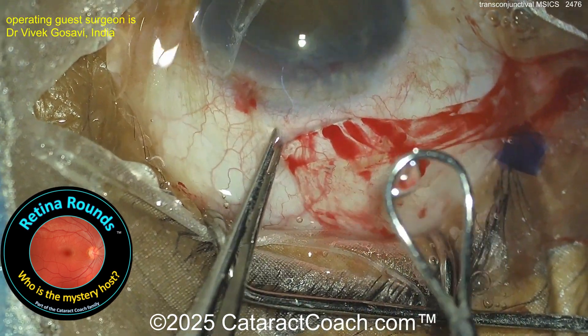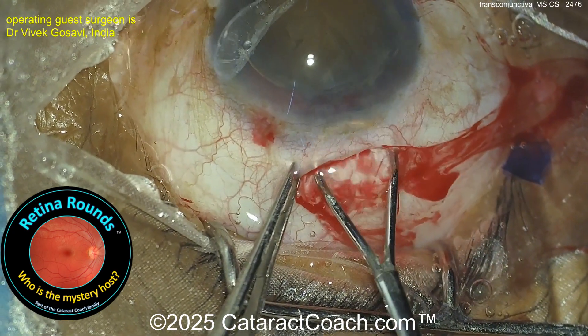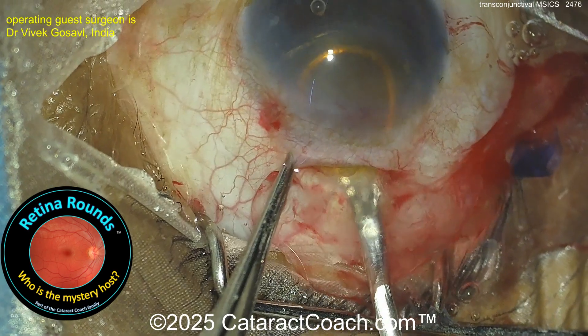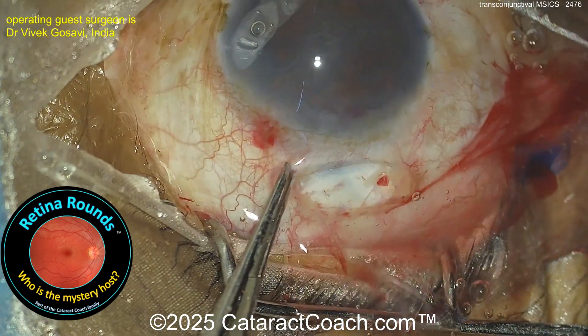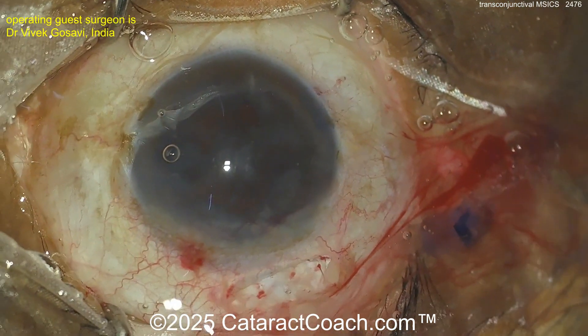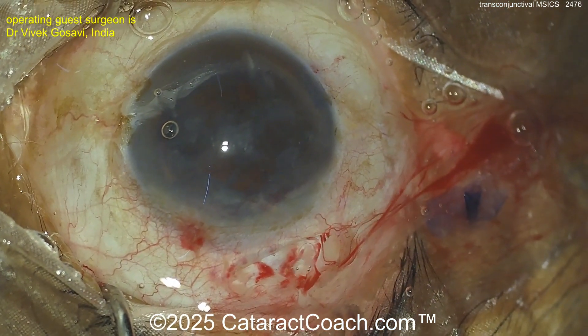Now going in with the lens loop — get that nucleus out. Remember, don't lift up against the cornea; push it down a little bit. There we go — there's the lens delivered like a baby. Now let's clean up — probably going to be a Simcoe cannula, so I'm guessing the surgeon is not going to be using an automated phaco machine here.